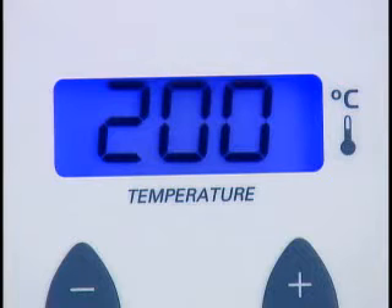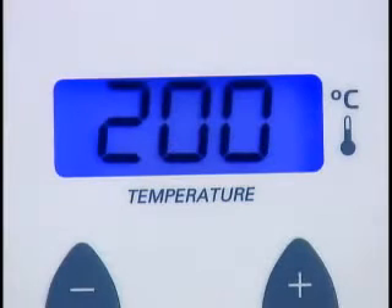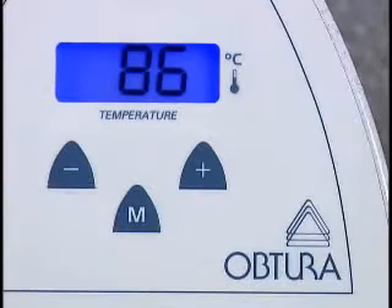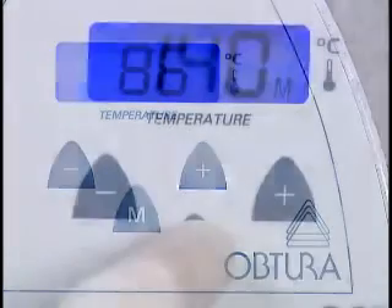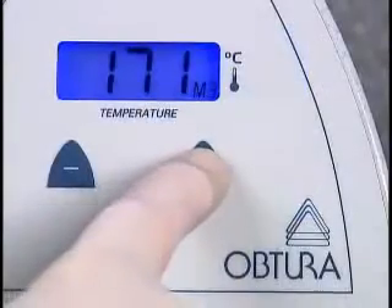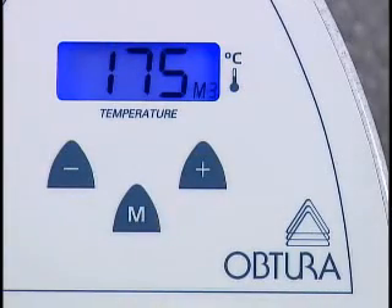A quick press of the memory button displays the temperature associated with the memory preset on the LCD screen. The preset temperature will be indicated for approximately five seconds, after which the temperature display will change to the unit's actual temperature. To create your own preset temperature, first choose your desired memory preset, for example M1 or M2. Then within five seconds, use the temperature up or down buttons to set the desired temperature.